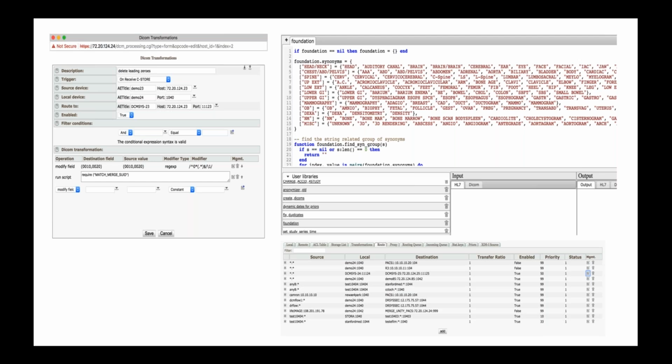The code here looks a little bit daunting, but really all this is saying is, let's match. If it's this type of study, here are all the different synonyms you might see. And these are the types of exams we're going to want to prefetch for that scenario. That way, we're not just saying, just fetch every other plain film or every other modality match. If you've got an ankle and a chest, that doesn't make a whole lot of sense to fetch. So through trial and error and some work, we were able to come up with this matching algorithm that's really pretty basic.